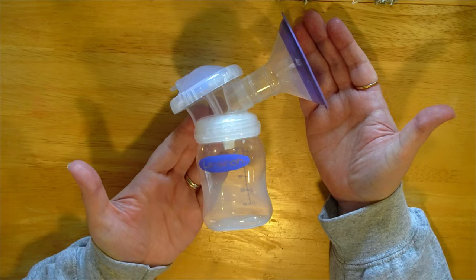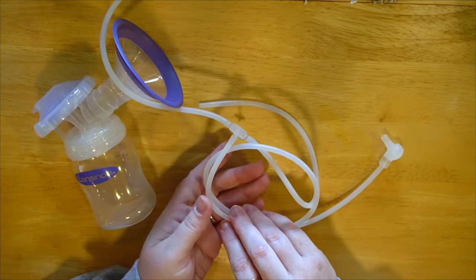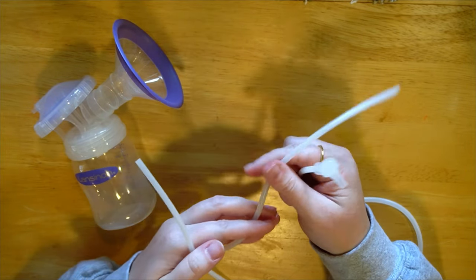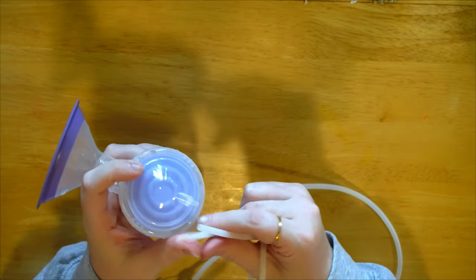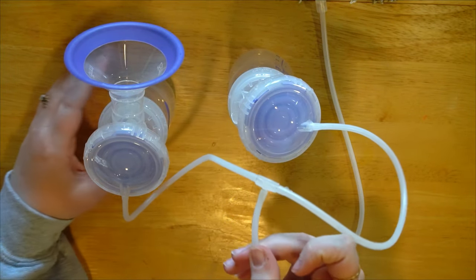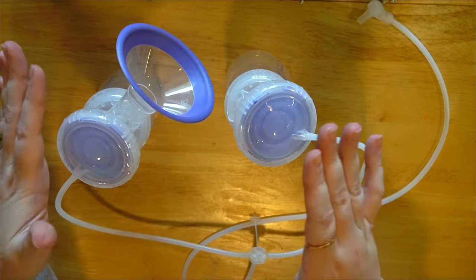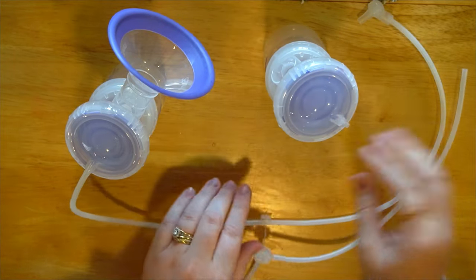I also want to quickly talk about the tubing. If you wanted to double pump it's pretty straightforward — this end goes into the pump and this goes on the back of one of your pump parts. There's a T-connector down here that flows into the main tube going into the pump. That's typically how double pumping goes.